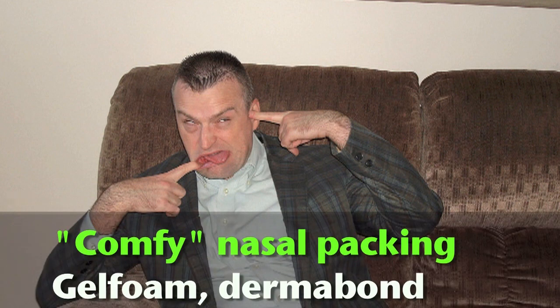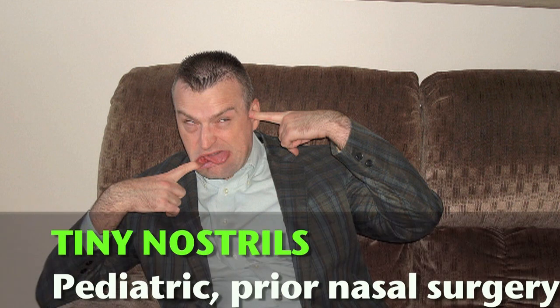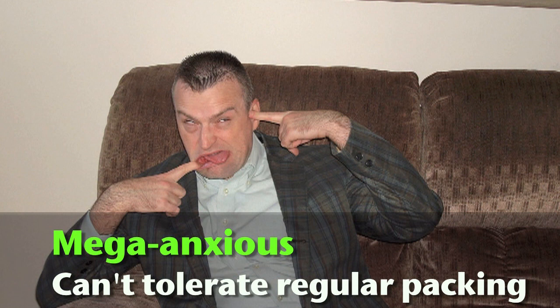I'm going to be showing you a way to do a nasal packing just using some gel foam and tissue adhesive like dermabond. The reasons we need to use this sometimes are people with incredibly tiny nostrils. That's actually happened to me. Kids, people with bad rhinoplasties, etc. People who totally freak out at the idea of a rhino rocket and will not tolerate it at all. That's also happened a couple of times too. So here's what you do.